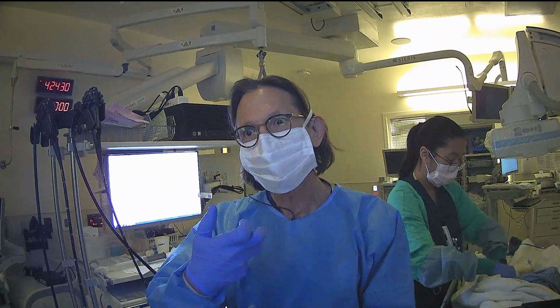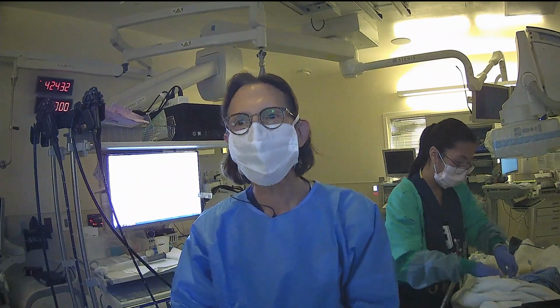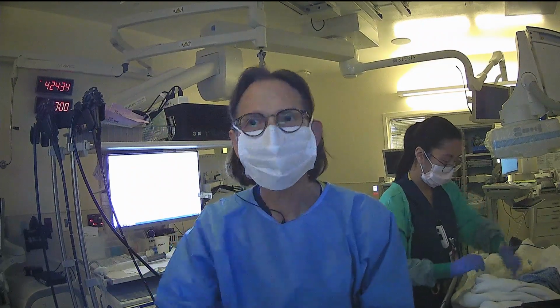We're going to go to another center. We only have 5 minutes. Yeah, okay. And aspiration risk, regurgitation.